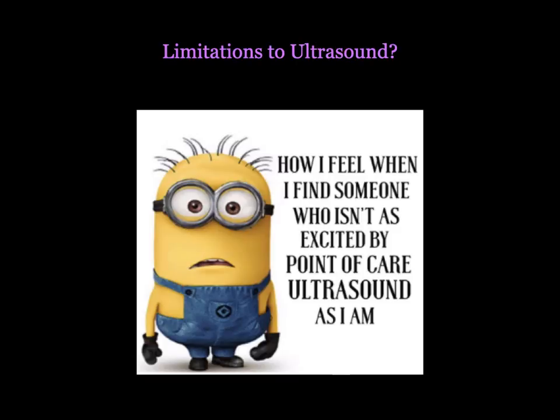So limitations to ultrasound, this is something that we have to be very cognizant of if we're starting to use point-of-care ultrasound in the emergency department on our patients. Certainly one of the most frequently talked about limitations is bowel gas. If you have a patient with a lot of gas, and this is particularly salient in patients in whom you are looking for a AAA, it can be very difficult to find what you're looking for. You can certainly apply firm pressure and see if the bowel peristalsis is out of your way, but do keep in mind that this can be very painful for a patient.